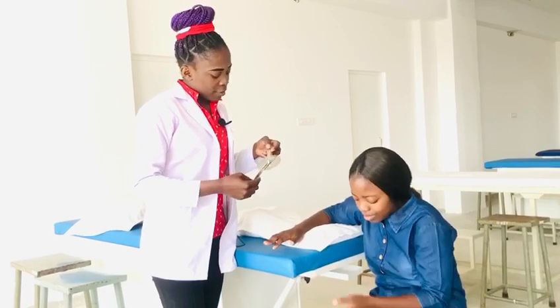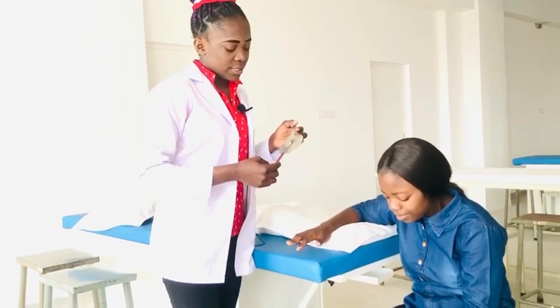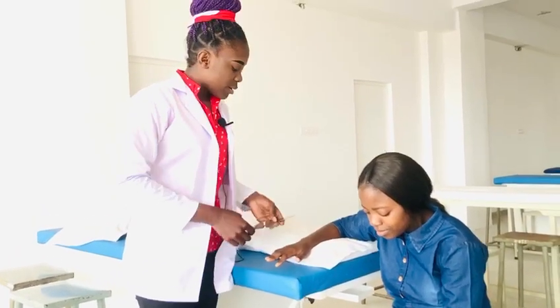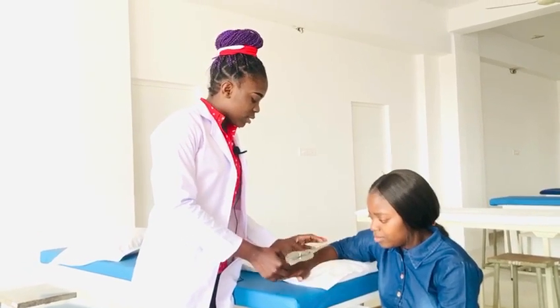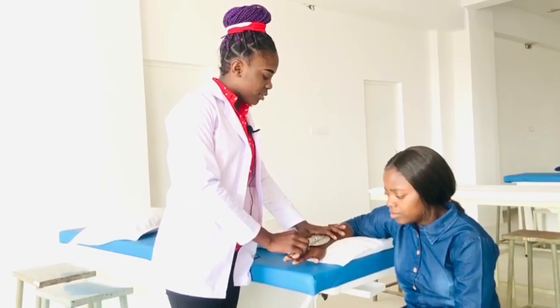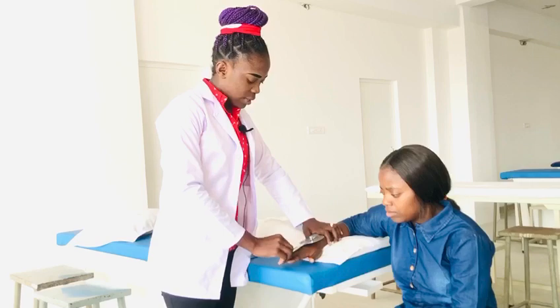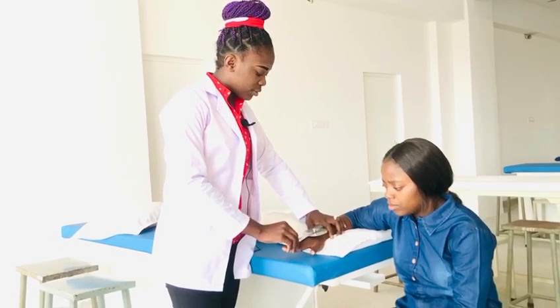For ulnar deviation, the normal range is 30 degrees. For radial deviation, the same axis is on the capitate — then perform radial deviation.